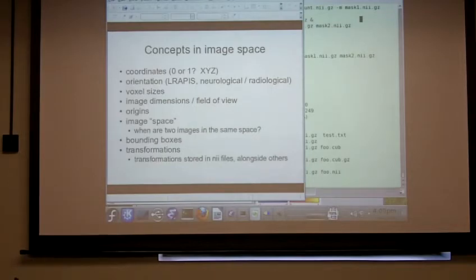There is now floating around, however, a set of brain images that are, by all other measures, in MNI space, but actually have a corrected origin that really is smack in the middle of the anterior commissure. At this point, I don't know who to blame for this situation. But the point being, once again, that you need to understand the coordinate system that you're looking at and report it correctly if you're reporting articles.